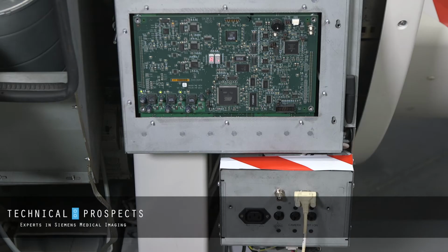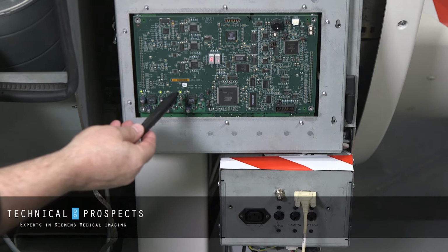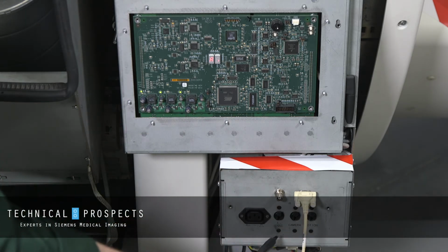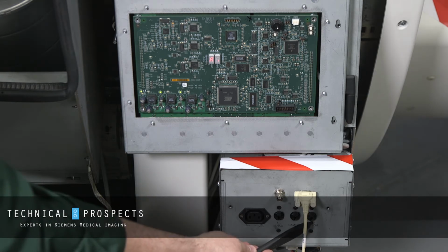Today I'm going to show you how to simply reset and reinitialize all the motion electronics in a Symbia nuclear medicine camera. Located underneath the left side of the gantry, we have the G-Con board. There's a cutout in that cover for these three breakers right here. This is the SNAC breaker, the camera breaker, and the motion breaker.